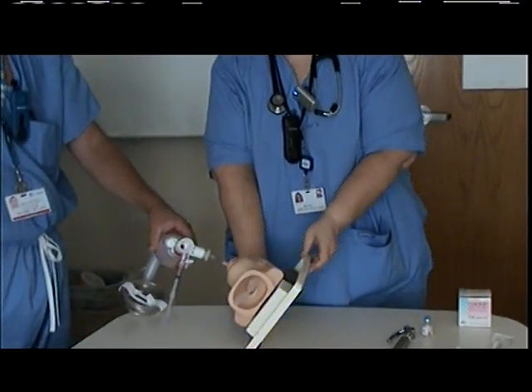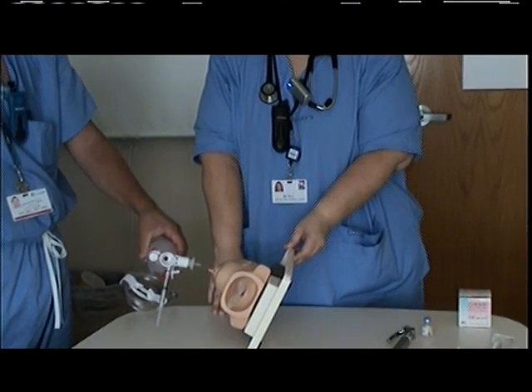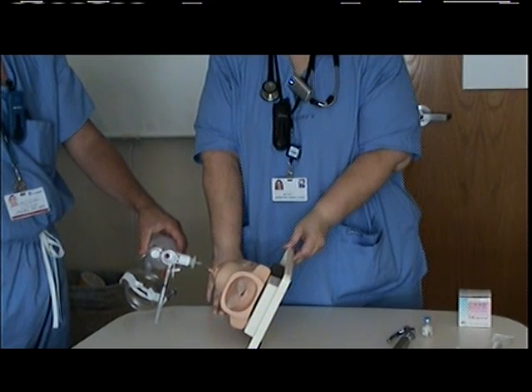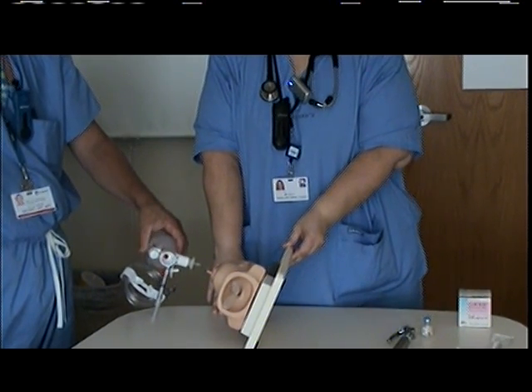Then you're going to place the infant on his right side and continue to ventilate at a rate of 40 to 60 breaths per minute and a pressure of 20 to 25 centimeters for one minute while you monitor his vital signs closely.